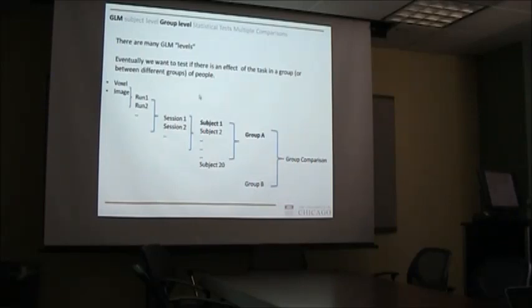Right, and the idea is that you're running this model basically on each of these levels, and the most important thing is sort of the subject and the group level.